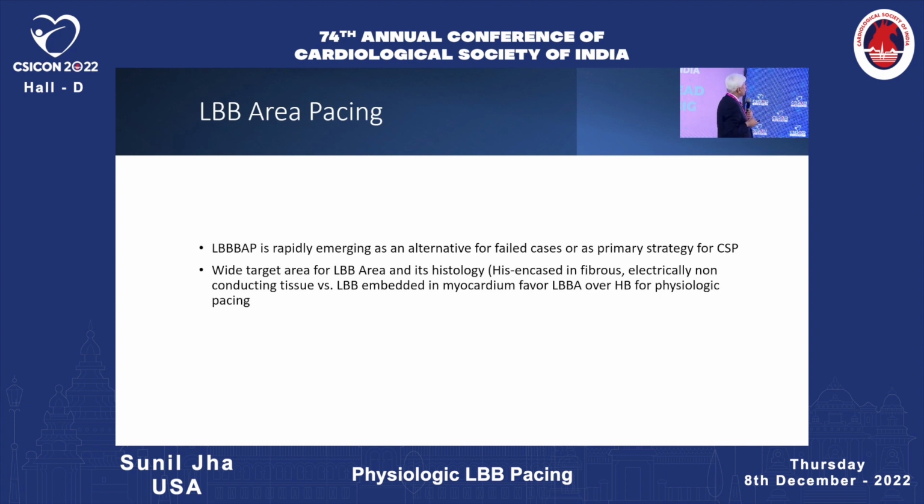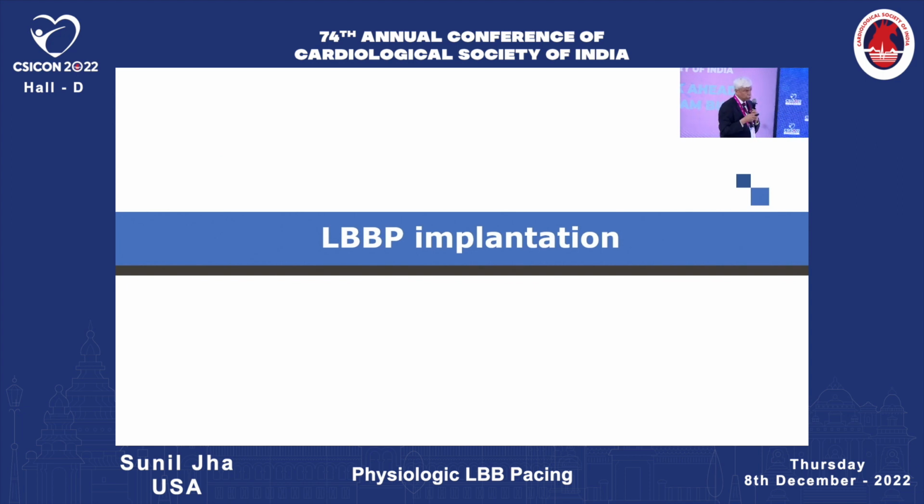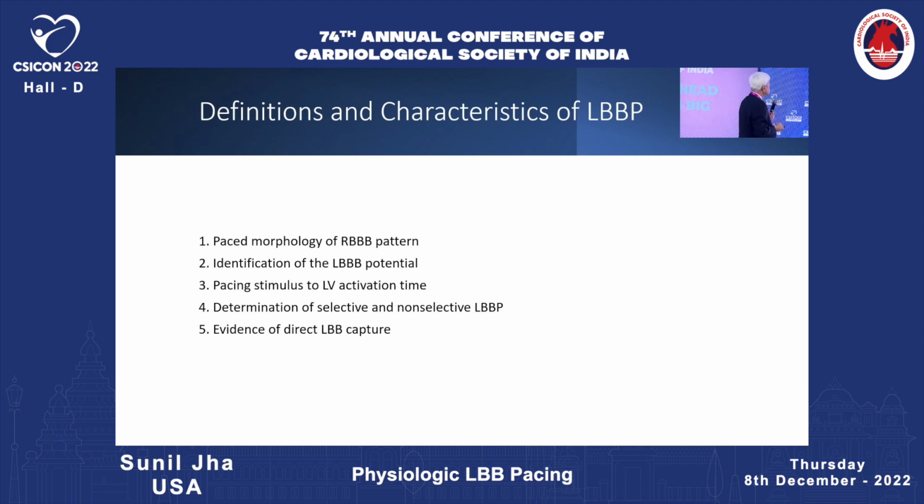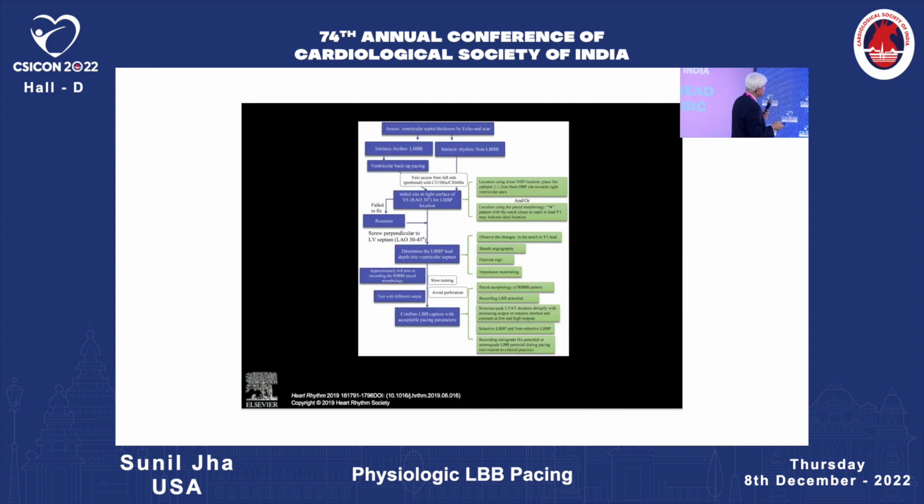physiologic pacing. Okay, so quickly I'm going to go over the left bundle branch pacing technique. I won't spend too much time. This was from Dr. Vijay Raman, and I know the slide is not very big, but basically it has two parts. One is how you fix the lead. That is some practice, and it is much easier than His pacing.